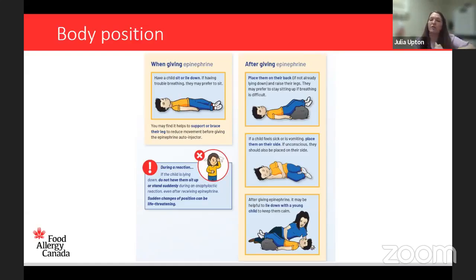You don't need a hugely forceful motion to inject. The machine kind of triggers on its own, which again we'll show, but I can just show here that you can hear that the click happened, and then the needle would have come out in that setting. Another thing that I'll show you when we do the demonstration is there's no button to press. So it really is on this one that the back comes off, and then this is the demo, so I can show you on my arm, but I'll show you where it is normally, that when you push, that's the click that's making it come out. There's nothing that you need to touch on the back.